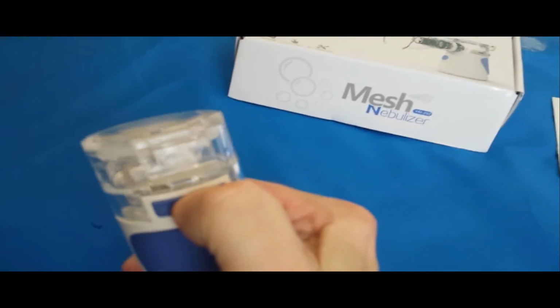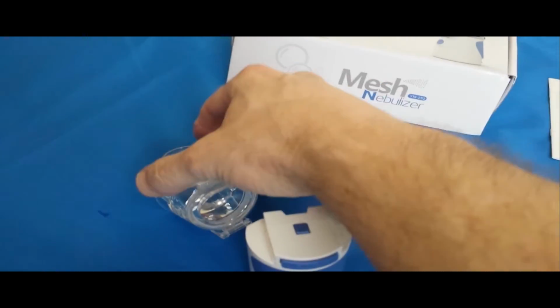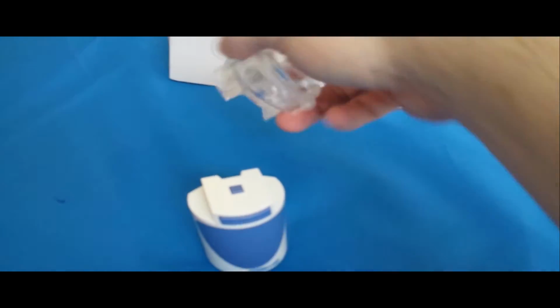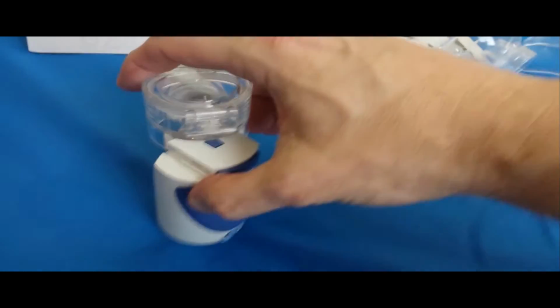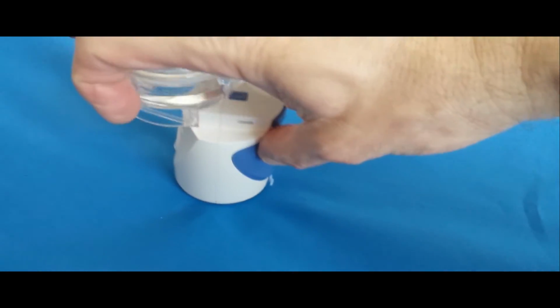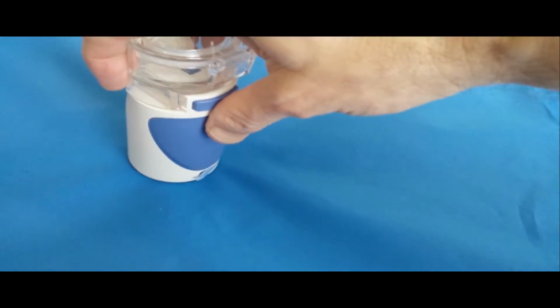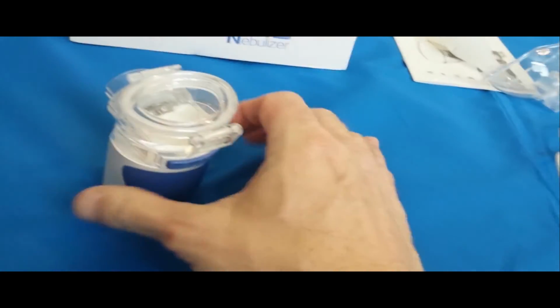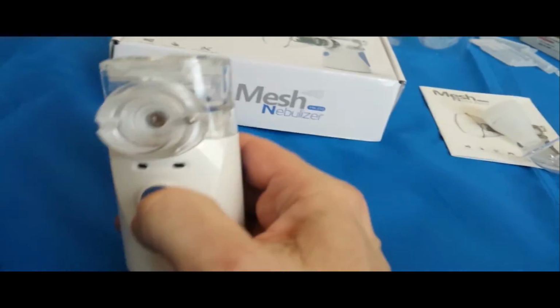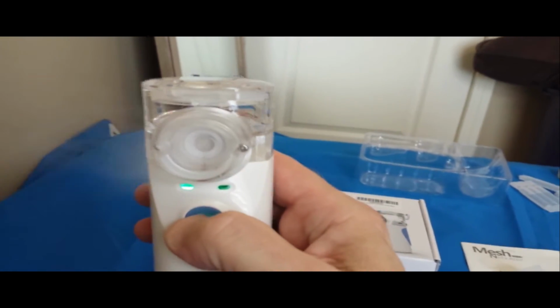To do that, you press the bottom piece in, and then you push the top piece off. I'm going to try that a little bit easier here. This attaches by sliding on to this piece here. Make sure it's fully pressed in, because if you don't have it pressed in all the way, what will happen is when you turn it on, it'll run for like a second and then turn off.